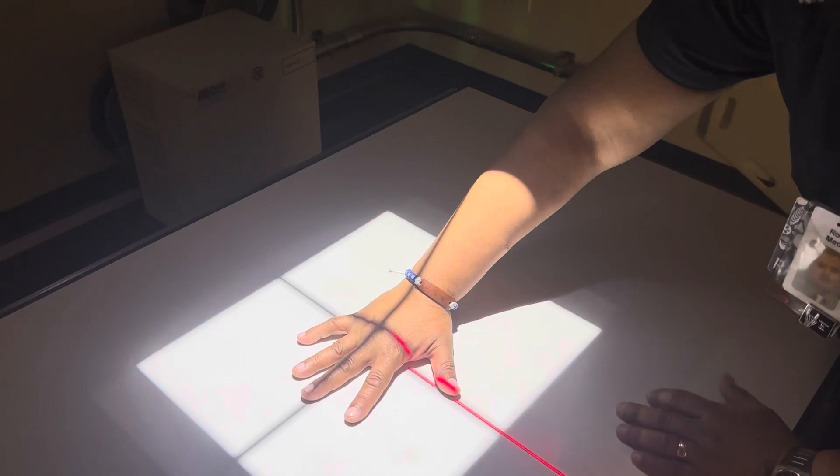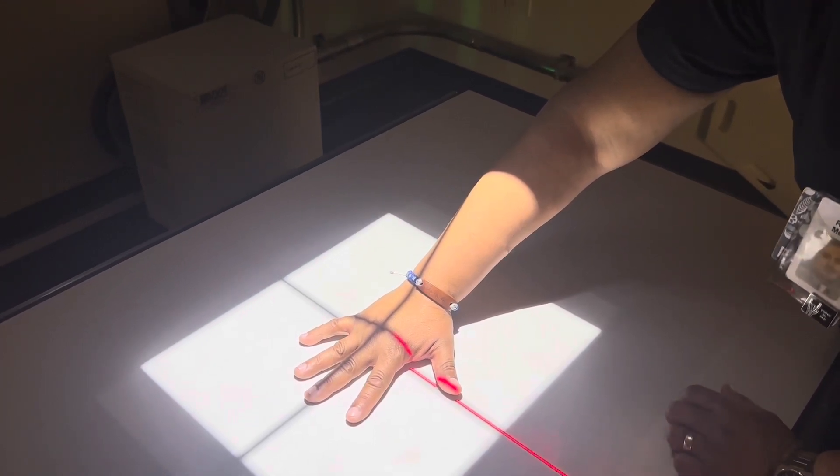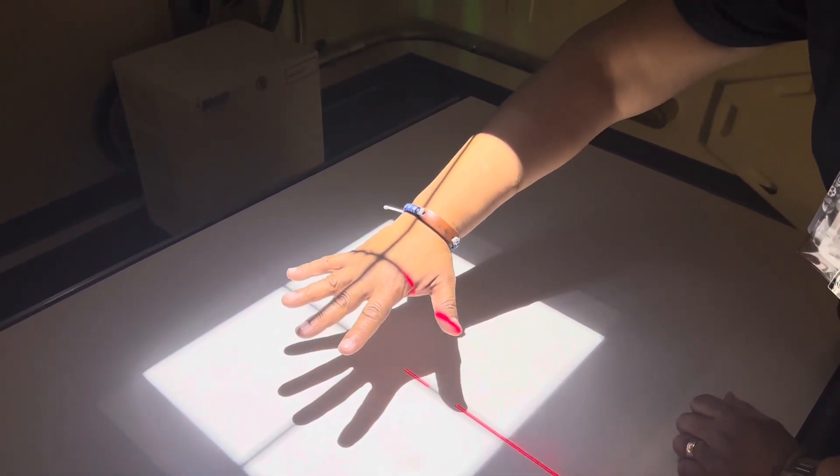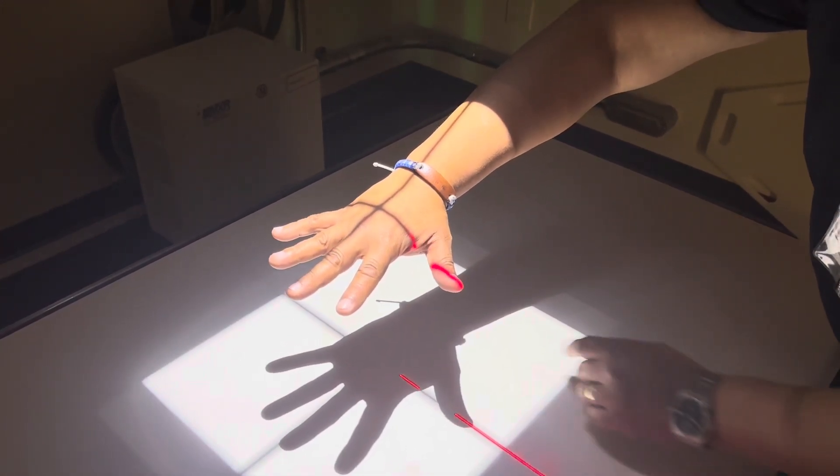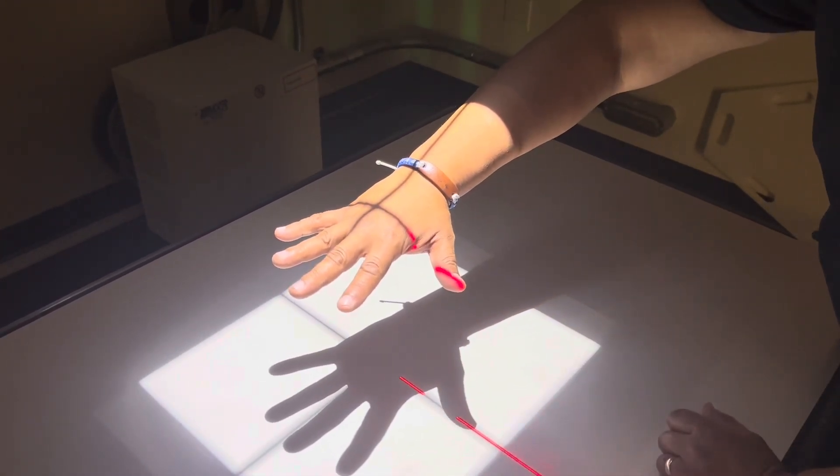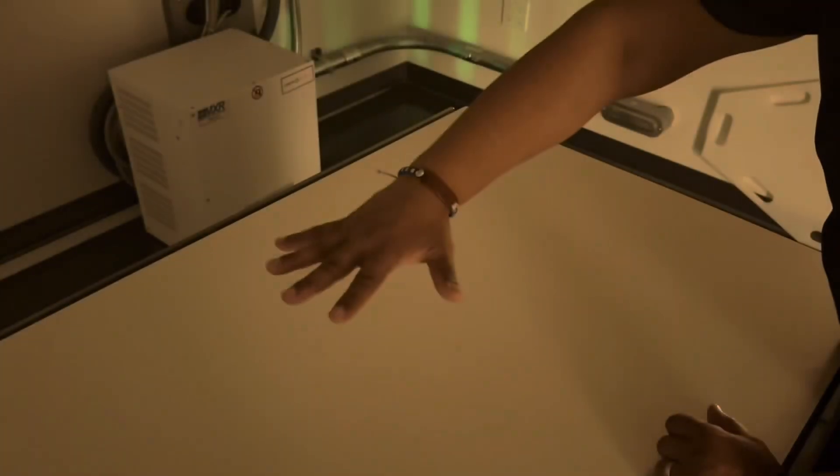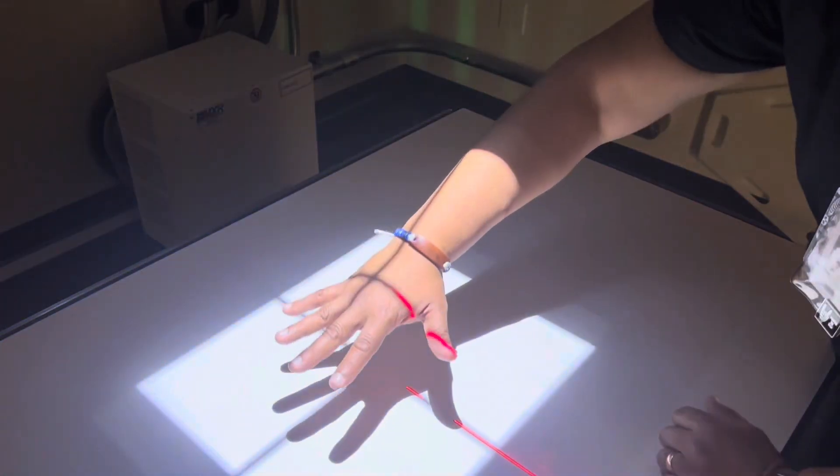But again, when you have less shadow it's going to increase the sharpness of the structural edges. So you want to decrease your OID. If you increase your OID, look how big the shadow is getting. So you would think that that's better but actually the edges are going to get a little bit blurry. So we want to make sure that we get a chance to minimize the OID.